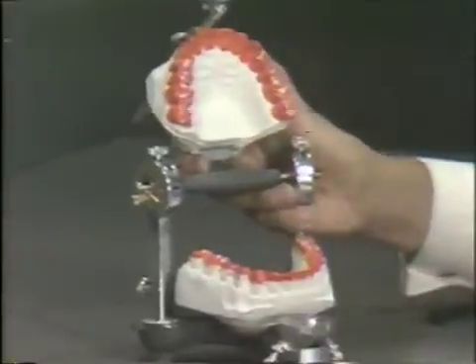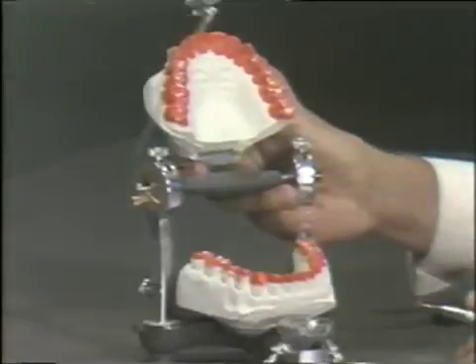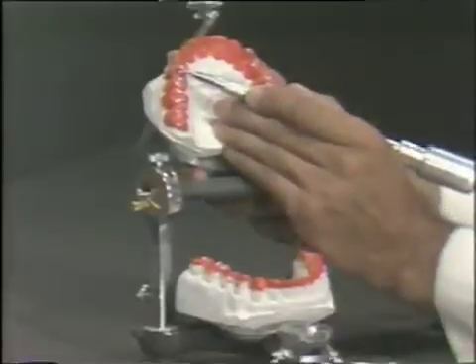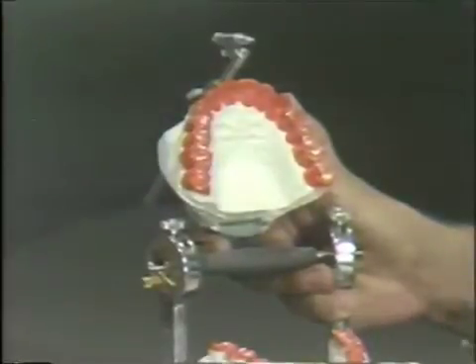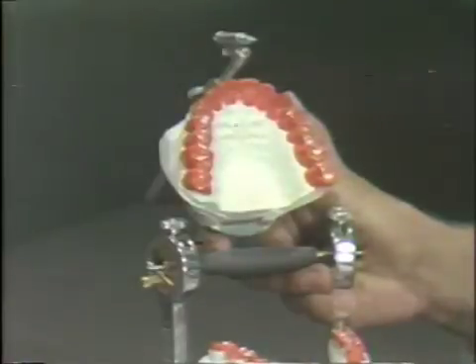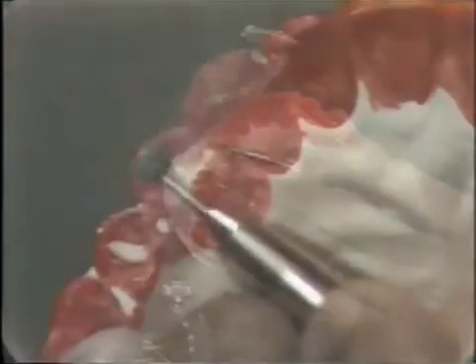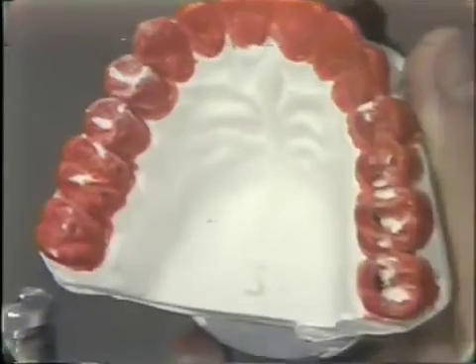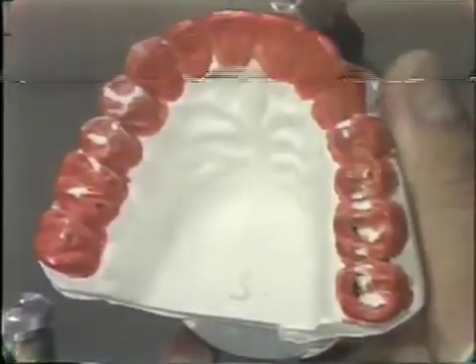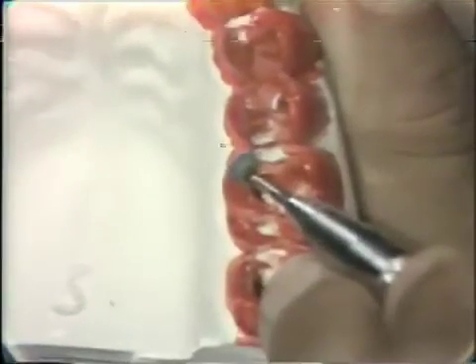We'll go back to the maxillary cast and remove the areas we find necessary to correct. Since this is the only cusp tip making contact in this lateral excursion, it would be highly unlikely that this tooth could support all of this contact. So we will remove the buccal of the upper and gradually take some of this ridge down to decrease the amount of contact in working excursion. On the other side in the molar area, we would reduce the balancing — taking it off the upper because this cusp is larger and more easily contoured. The actual area of support is probably in the area of this cusp tip.